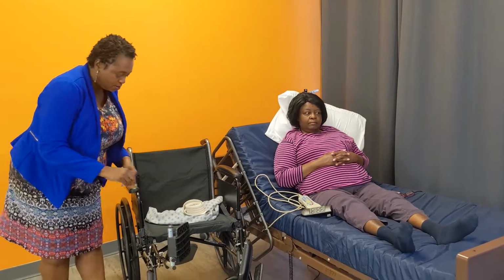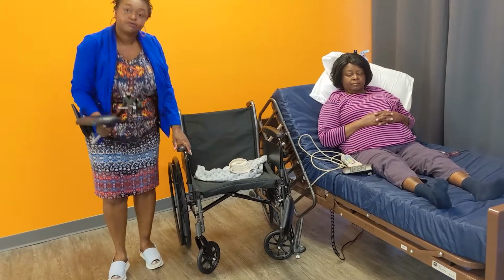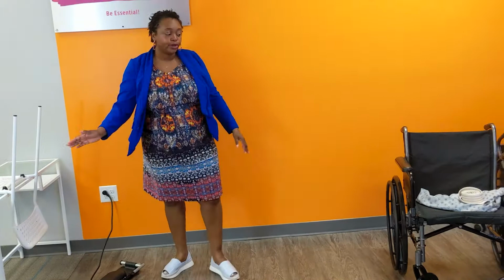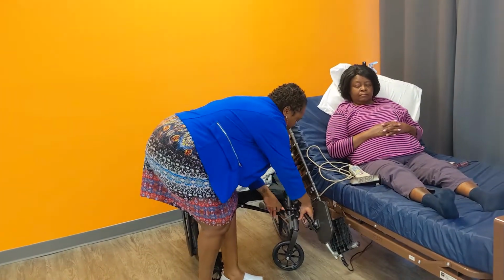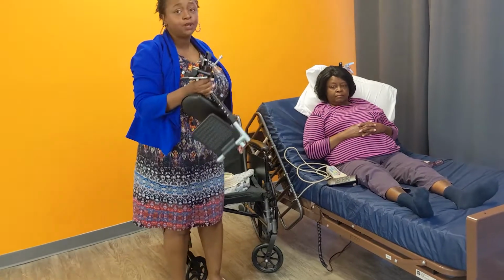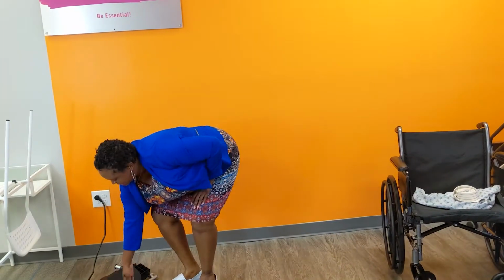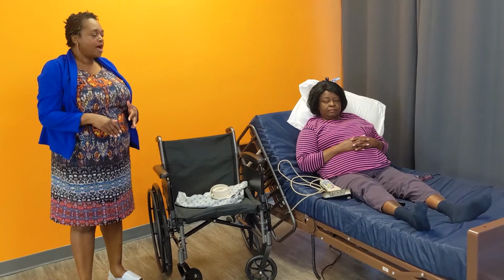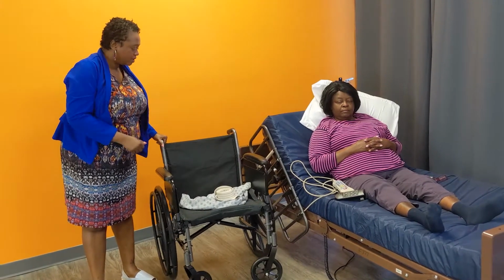And for the safety of this skill, I'm going to take the footrest off. If you don't know how to use a wheelchair, make sure you watch my video where I show you how to lock the wheelchair and take the footrest off. So make sure you take off the footrest. A lot of checklists like Prometric and things say you could lift it or swing it, but I say actually take it off.